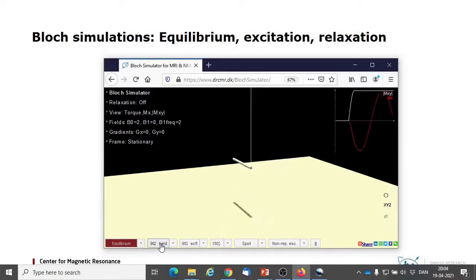In real life, T1 and T2 are sample properties, but since this is a simulation, we have flexibility. Relaxation is currently disabled, for example, but we can now introduce it.